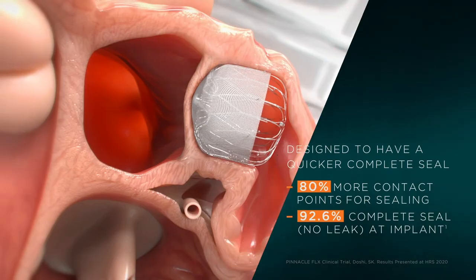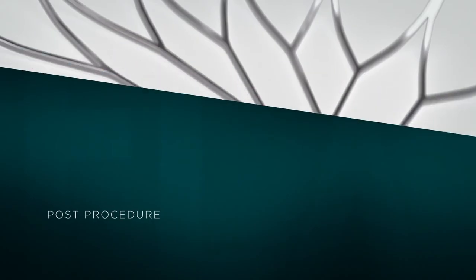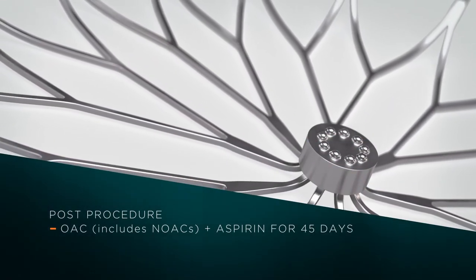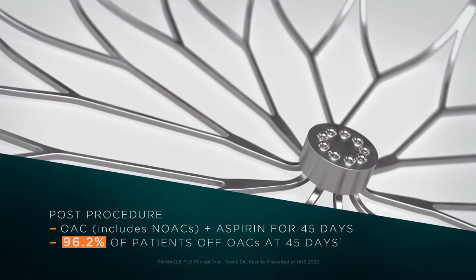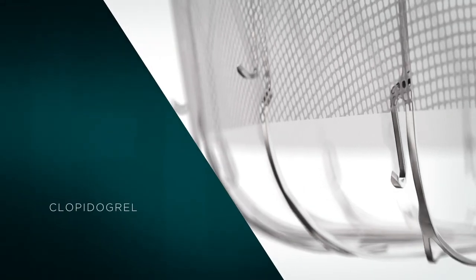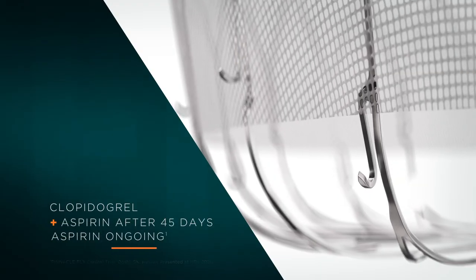Post-procedure, the patient takes an oral anticoagulant and aspirin for at least 45 days until a complete seal is confirmed by TEE. After discontinuing the oral anticoagulant, the patient takes clopidogrel and aspirin followed by ongoing aspirin therapy.